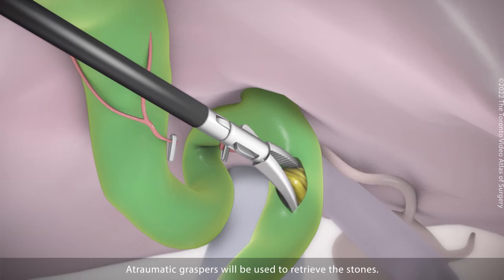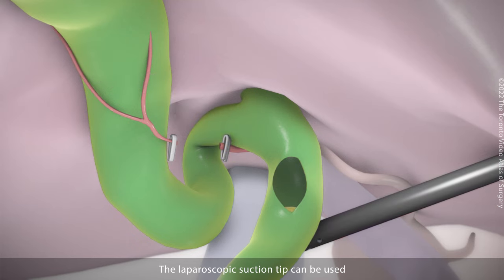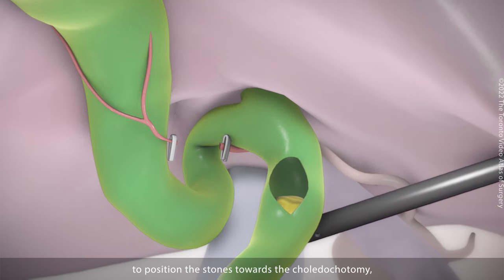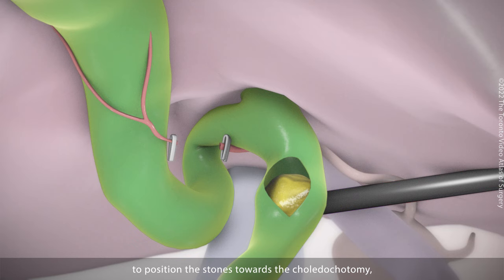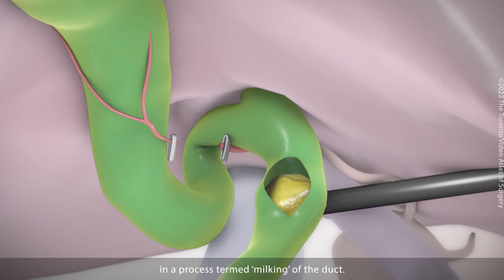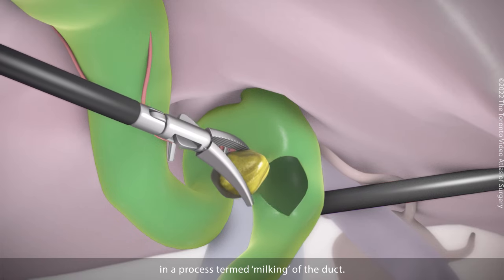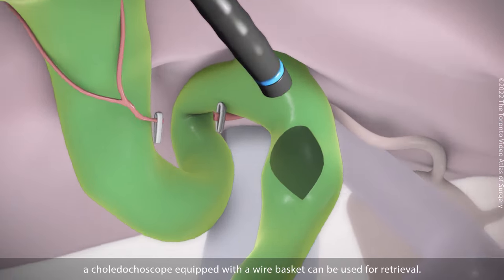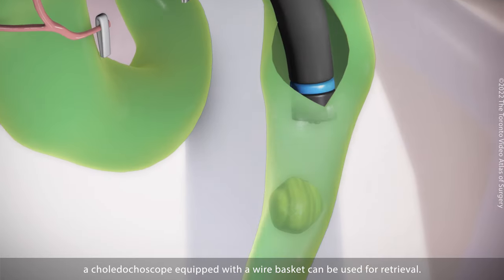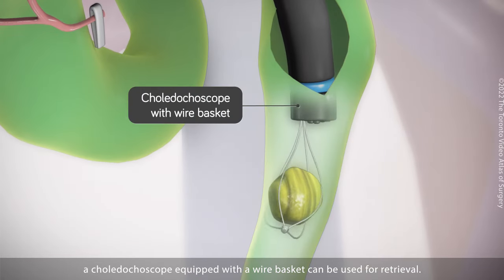Atraumatic graspers will be used to retrieve the stones. The laparoscopic suction tip can be used to position the stones towards the choledocotomy, in a process termed milking of the duct. For distal stones, a choledochoscope equipped with a wire basket can be used for retrieval.